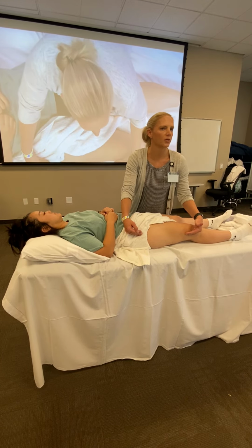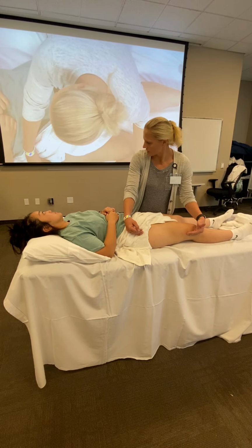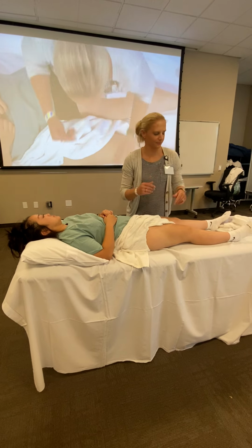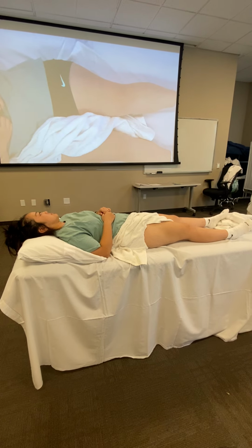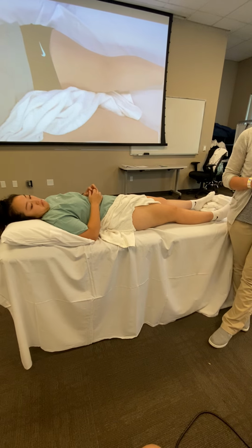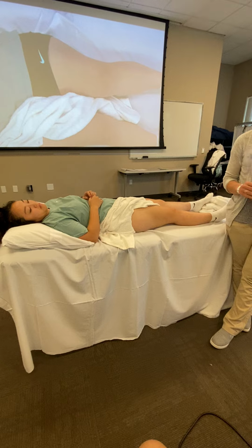Good. Normal hip flexion is 120. One of the sources says like 135, which I find to be fairly uncommon. So I would think of 120 for hip flexion. So we'll say 120. If you say 135 and can cite the source, you'll get the points. But we're gonna say 120.